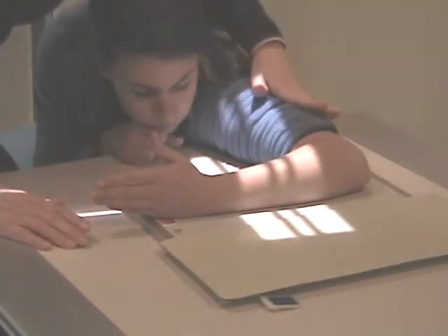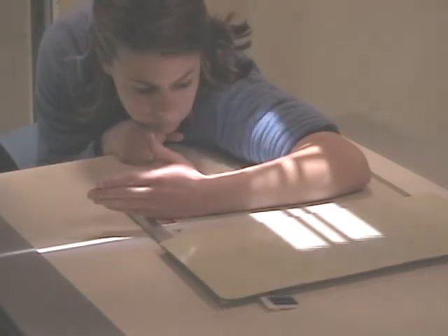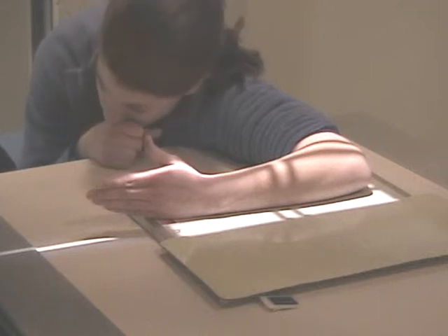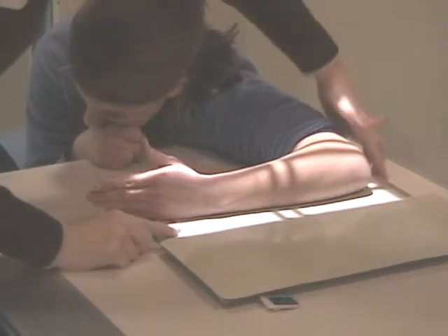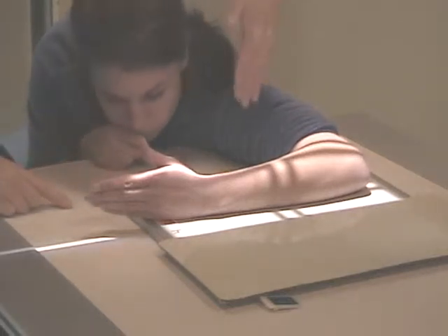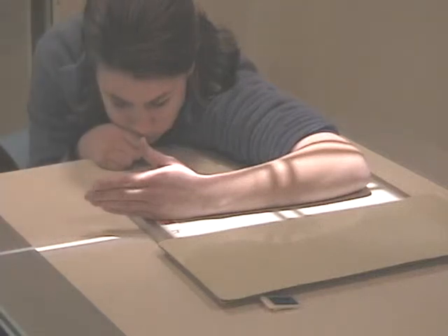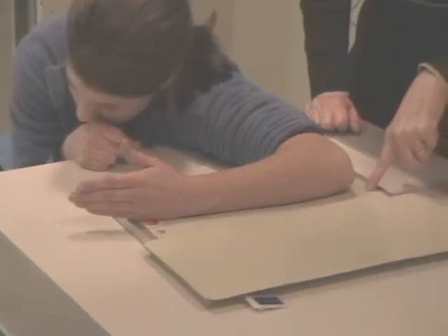Again, the forearm is bent at 90 degrees. Elbow joint is 1.5 inches from the film's edge. Equal light on both sides, baby light over the lead strip, a little bit of collimation on this edge, and this crosshair coming right down the forearm. And I'm making sure that the shadow of the elbow over here is 1.5 inches from film's edge.